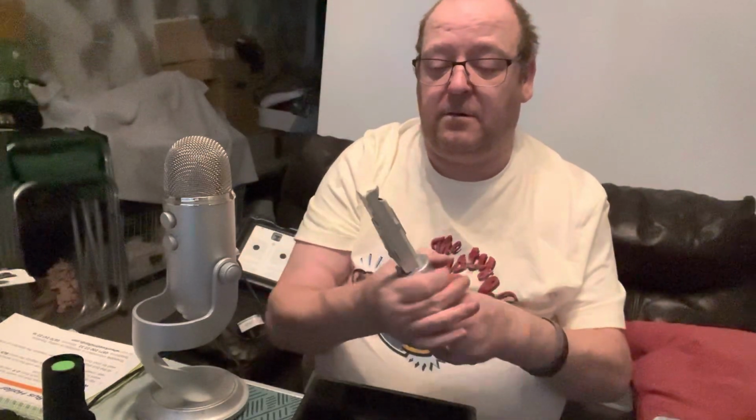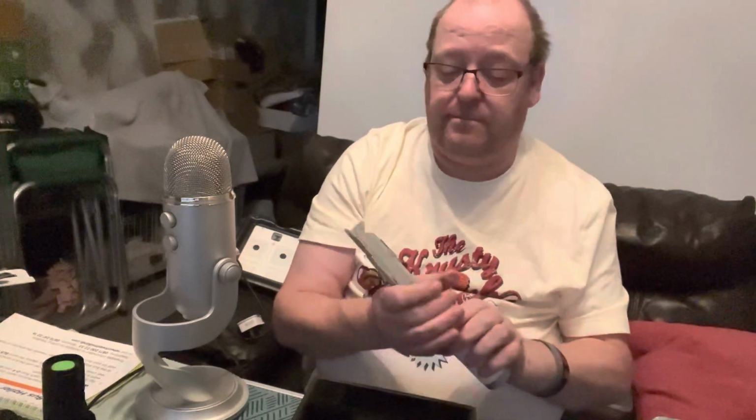I've now got a very special ophthalmoscope. It's a battery operated instrument. It has the dial on the back, which is with and without the red filter. I've got a dial on the side, and this helps with the power.